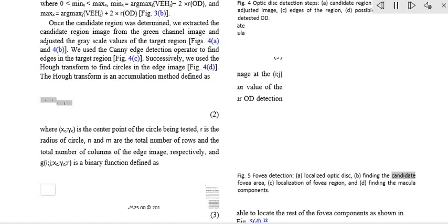Hence, we use texture features to distinguish retinal images from non-retinal images. Texture features model the repeating patterns of local pixel intensity variation in an image. In this work, we used Haralick texture features, which aim to describe the texture globally [21], and the edge histogram, which expresses the texture locally [22].